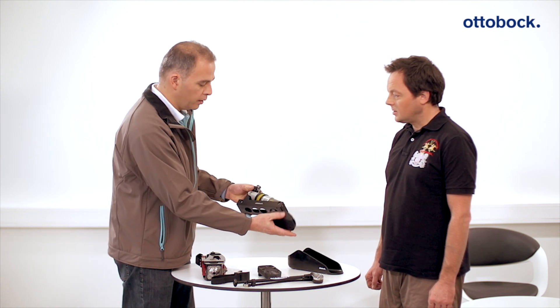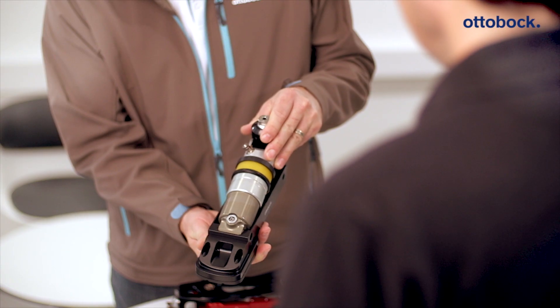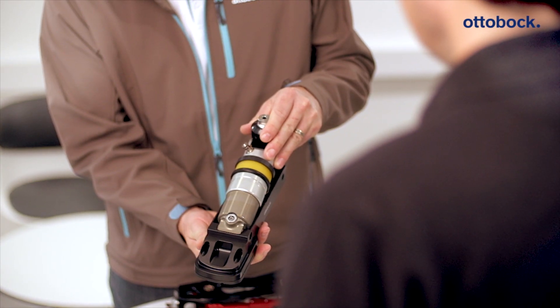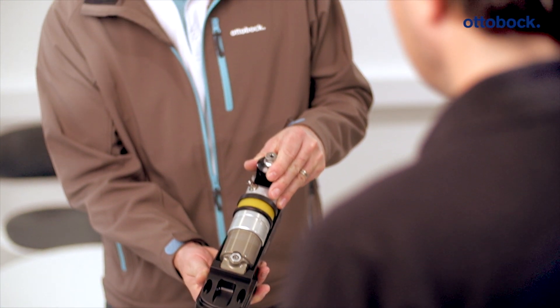A second version of the foot, the 1E2, is equipped with a polymer ring which increases the flexion resistance further. This offers increased stiffness, which can benefit advanced snowboarders with below-knee amputations the most.